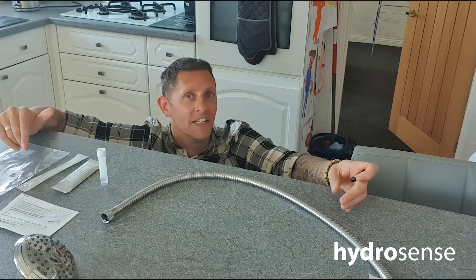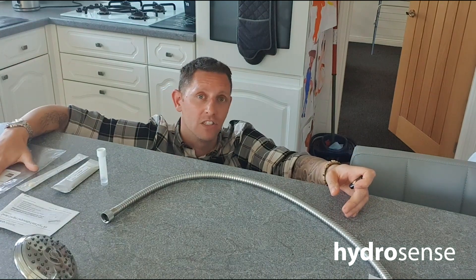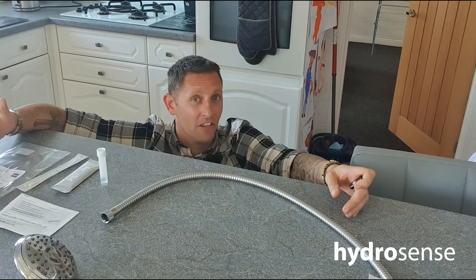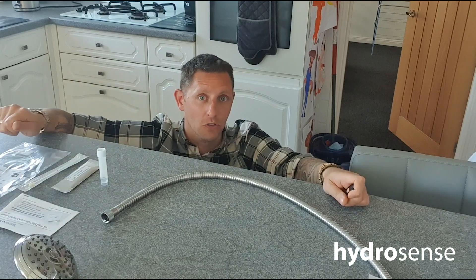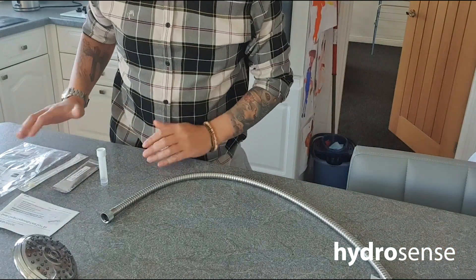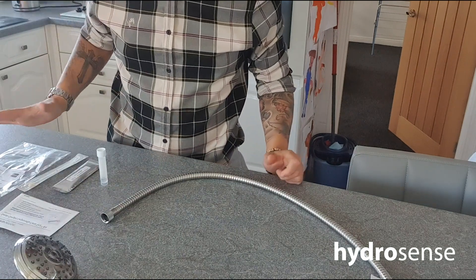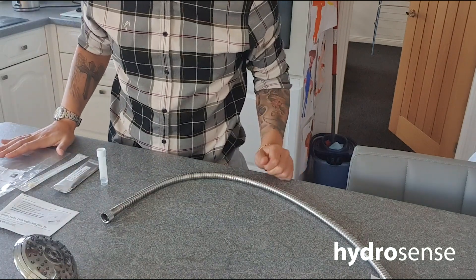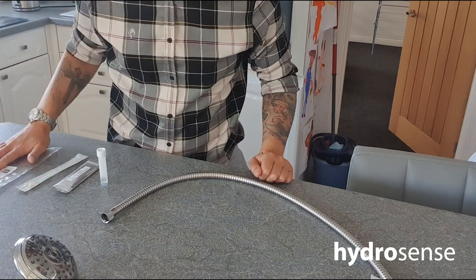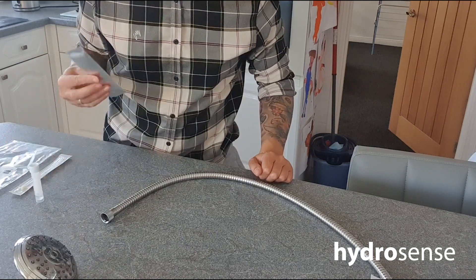Before we go and do our showerhead cleaning descale, I want to do a quick demonstration using our HydroSense single swab test kit to see if we can detect Legionella pneumophila serogroup 1 in this shower hose. The HydroSense single swab kit contains everything needed to carry out one test, and we also have a version which contains five tests. It includes the instructions, the swab, buffer solution and HydroSense.